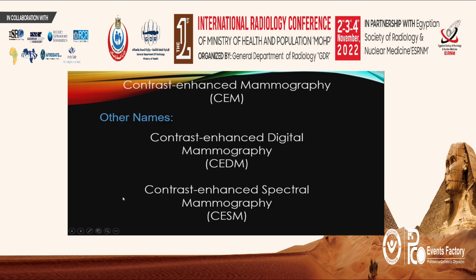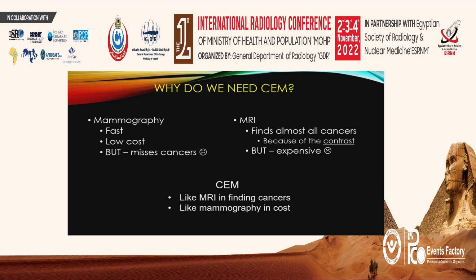So contrast-enhanced mammography is also known as contrast-enhanced digital mammography and more so as contrast-enhanced spectral mammography, which is a name given to it by GE. These are all different names for the same thing. So what is the motivation for contrast-enhanced mammography?